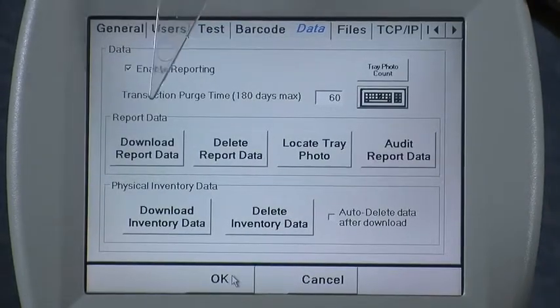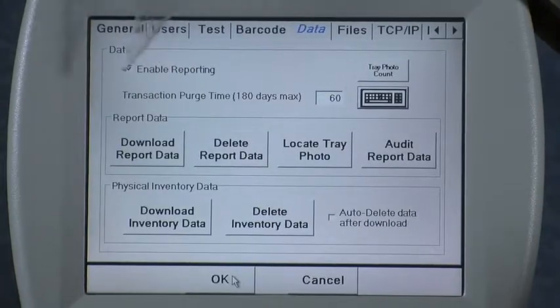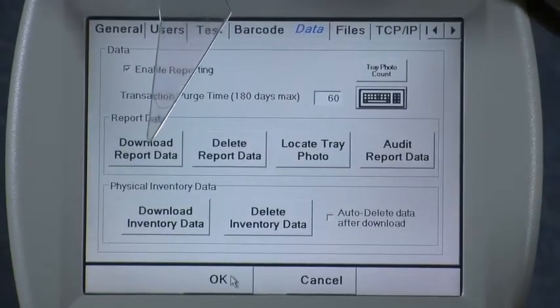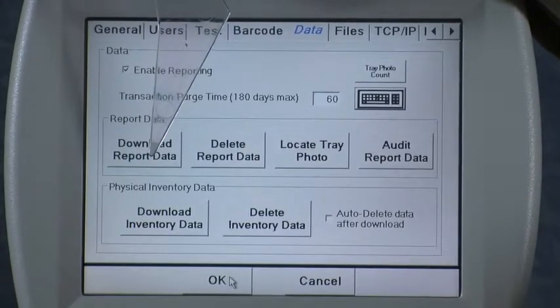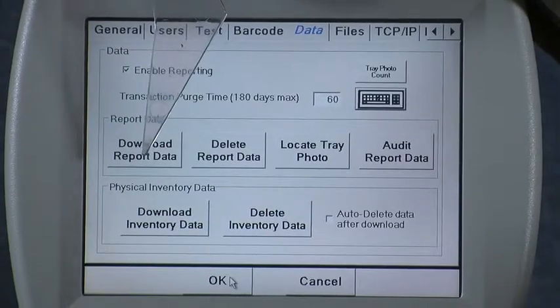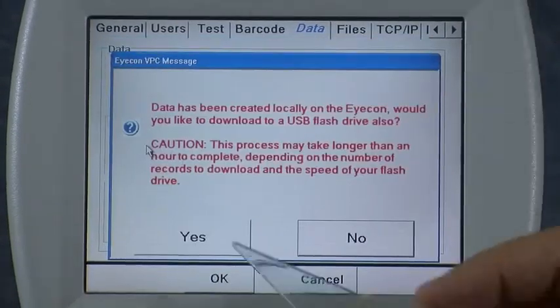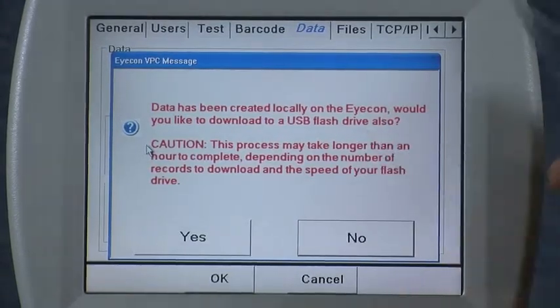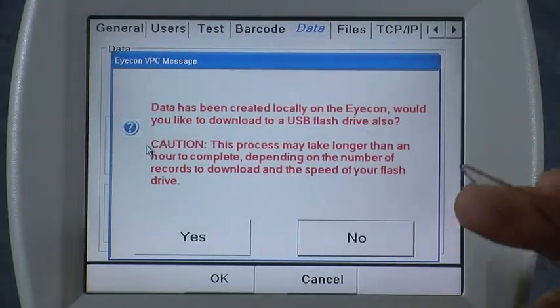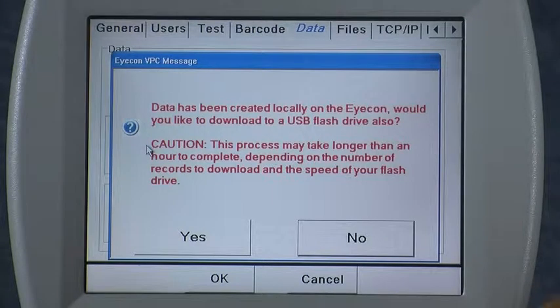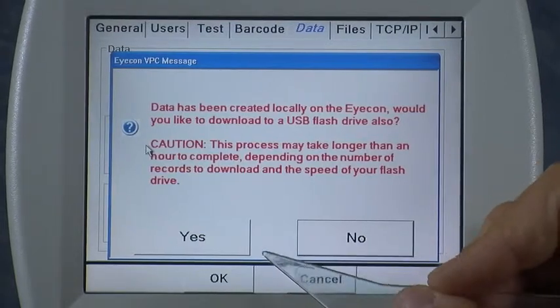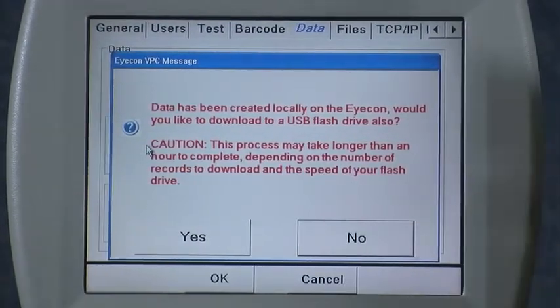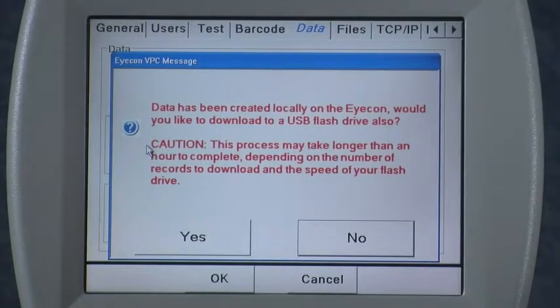The next section on the data tab is the report data section. The first button here, download report data, is used to download all of the transactions that are recorded when you either dispense prescriptions or use the count-only mode on the icon. Pressing that button gives you an informational screen saying a file has been created in a format that is easily imported into Excel. It also advises that you can copy that file to a memory stick, however it will also copy all of the JPEG files on board the icon, so it's warning you that this could take a little while.